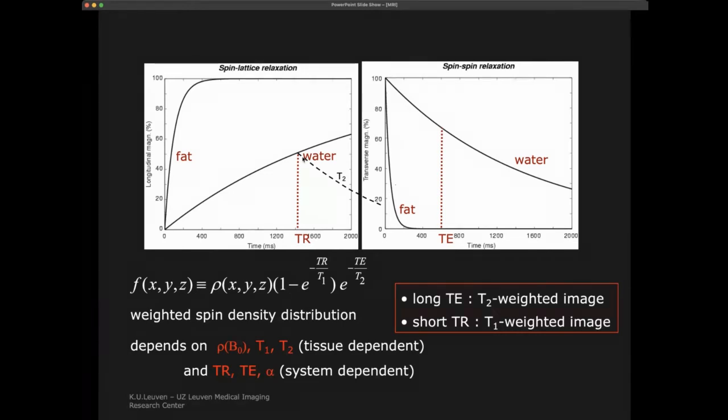And so by combining when I measure and when I flip again, I will actually be able to modulate the amplitude of the vector and have this amplitude correspond to a certain combination of T1 and T2. Keep in mind that they keep on happening together, so we also have a change because of them together.